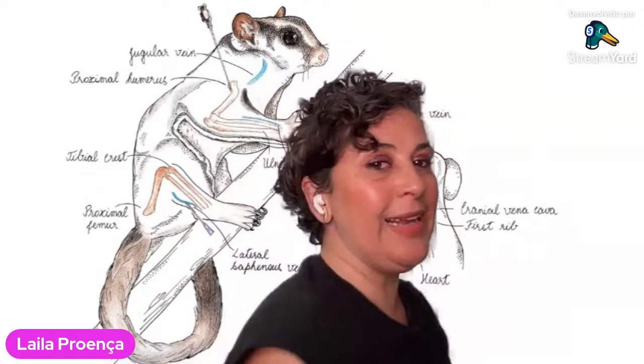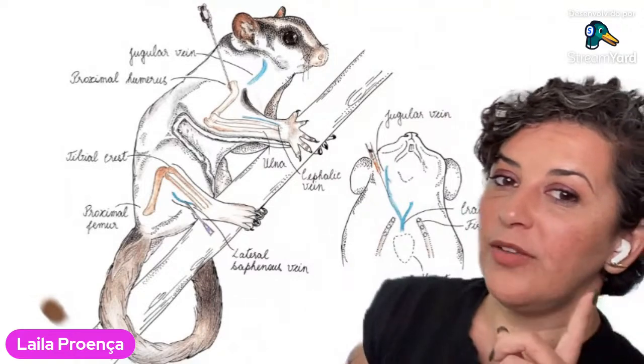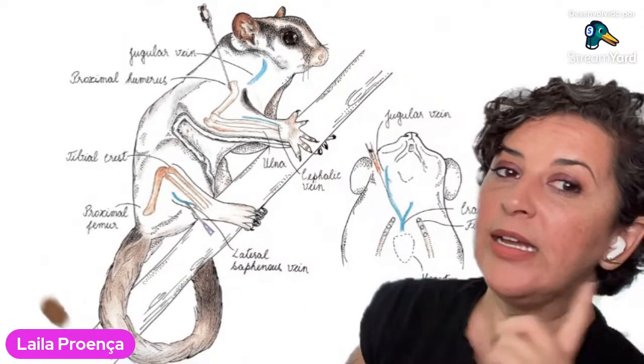Love a jugular, okay? Definitely recommend that for you guys, jugular vein. But we can all hear, calma, this way. There you go. Jugular vein, not vena cava, jugular vein.